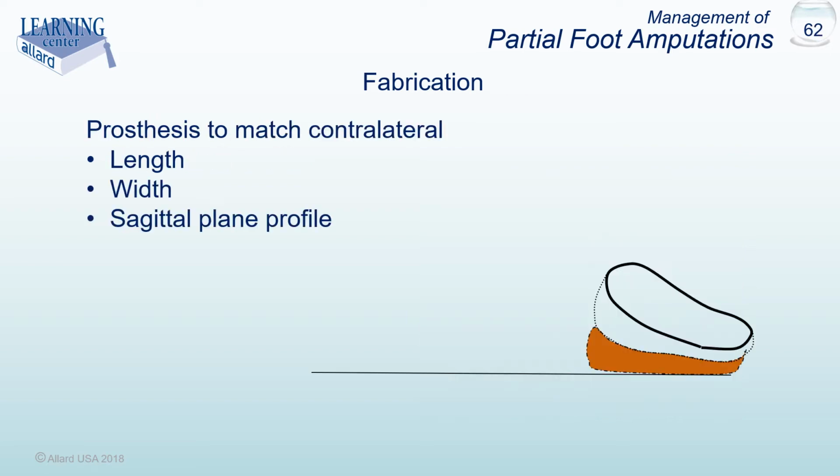The filler prosthesis is then fabricated, matching as closely as possible to the length, width, and sagittal plane profile of the contralateral foot.